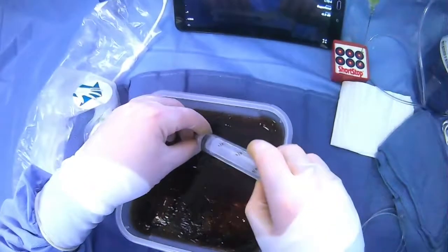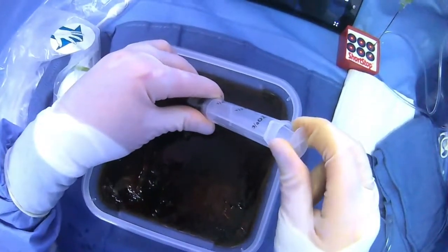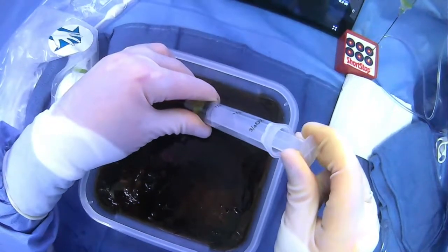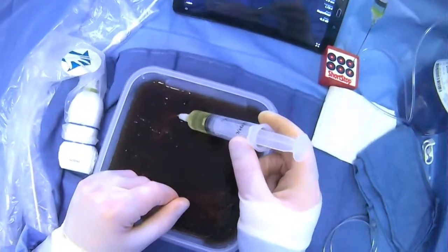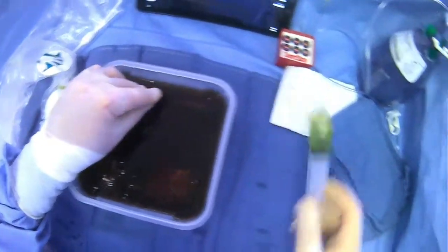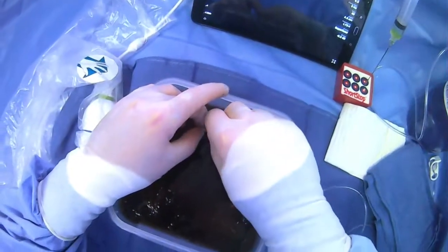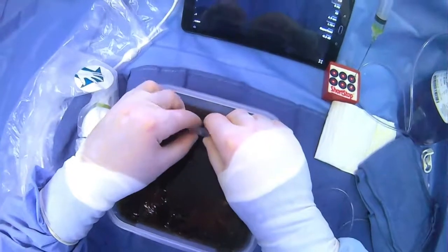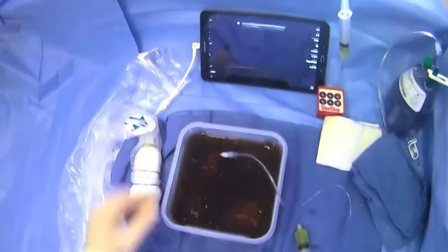Grab the syringe so we can actually take some for diagnostic reasons. We'll start taking some of the ascites — we can see we can take quite a bit out. Take as much as you need for diagnostic reasons and fill up the syringes to save them for later. When we're done taking what we need for diagnostics, we can hook this up to our IV extension tubing, and then we're set up to do our large volume paracentesis as well.